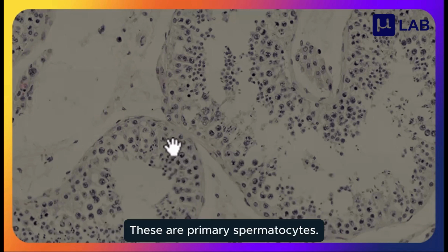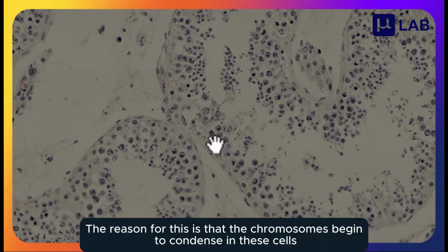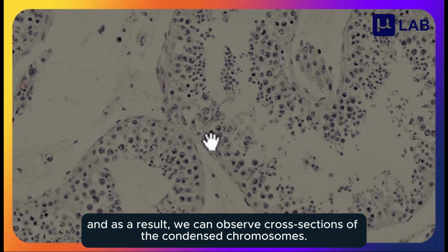Primary spermatocytes have nuclei with a dotted or thread-like appearance. The reason for this is that the chromosomes begin to condense in these cells, and as a result, we can observe cross-sections of the condensed chromosomes.